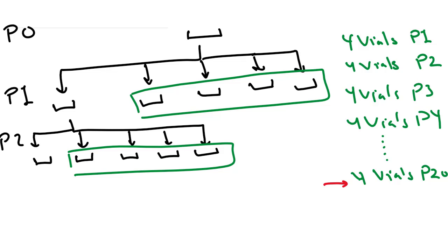Now, as I said, I'm being very conservative here because typically what I would do is I'll take 1 plate and do a 1 to 10 split. And some cell lines grow really fast, so you can actually do a 1 to 15 or something like that and immediately have a bunch of cells to freeze down. And really, instead of 4, 4, 4, I could have 10, 10, 10, and just have all these cells put away at different passages and always be able to work my way backwards. You get 1 vial of cells from somebody, you buy them, etc. You should be able to make an infinite supply for your lab.